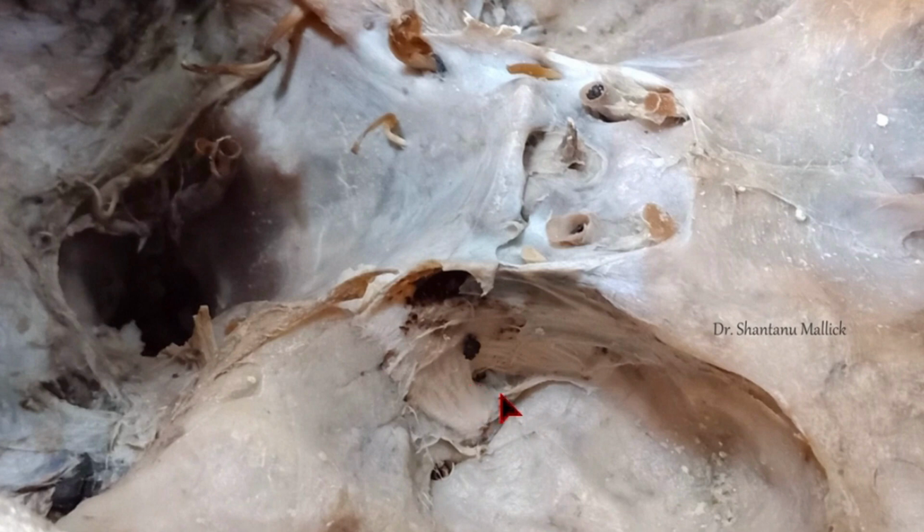The motor branch will be medial to it. So motor is always medial. I will tell you for every cranial nerve where it is having motor as well as sensory, the motor will always be medial to the sensory branch. Why it is, I will explain to you. And this is V2 and this is V1. So V3, V2, V1.